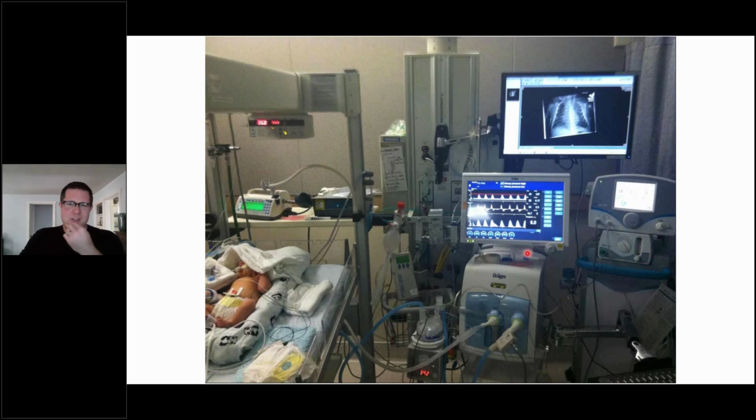Even when you're using mechanical ventilators that have an integrated tubing compliance factor that accounts for the compliance within the circuit and the compressible volume loss, there's bound to be some artifact. In time, the compliance that you have set within that ventilator based on your initial use check could not always reflect what the compliance of that circuit is over time. The compliance of the circuit is going to change as it warms up and as you expose that ventilator circuit or patient circuit to pressure. So if you are not using a proximal flow sensor, I would definitely suggest that you calibrate often, because there is some good data showing that in time the volumes, the pressures, the flow, everything could be affected. You're just better off using a proximal flow sensor, in my opinion.